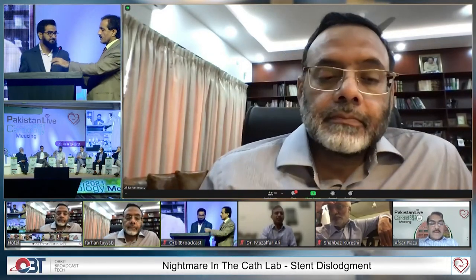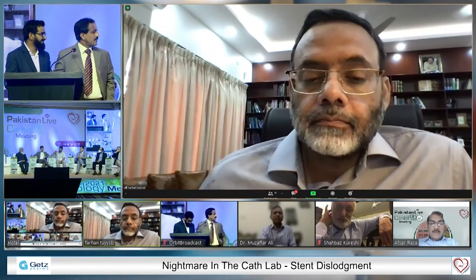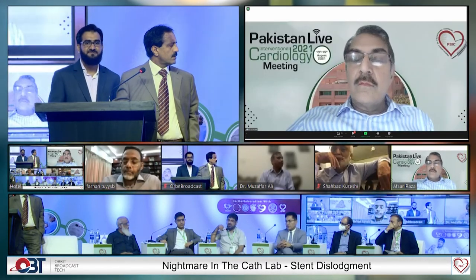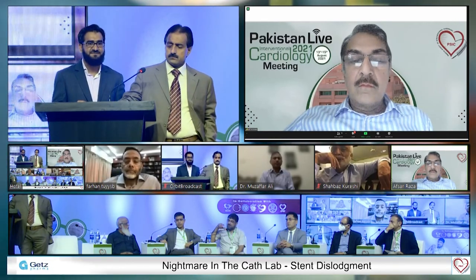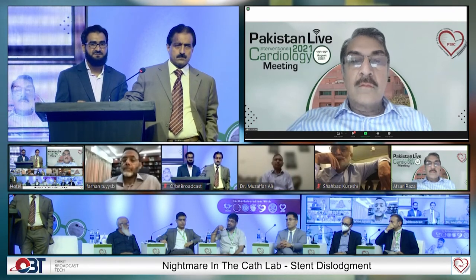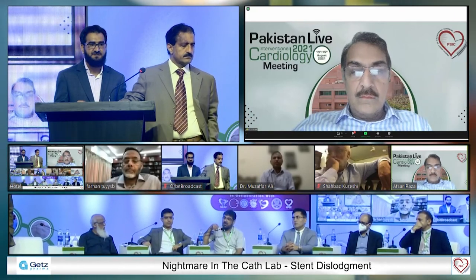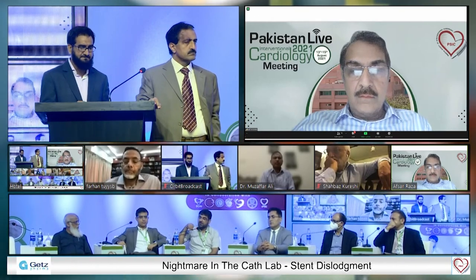Yes, I'm Dr. Kaleem from Karachi. I think this is a very good lesson for the fellows: they have to read the angiogram before proceeding with any intervention. The RCA, though totally occluded, is clearly calcified, with a tortuous vessel. You can see very severe calcification at the bend. So before proceeding to PCI, you have to prepare for good support.